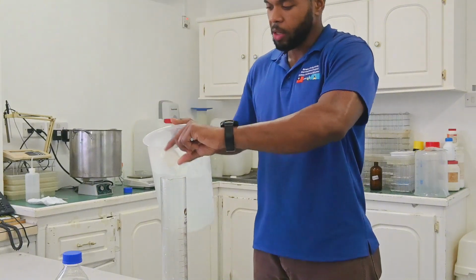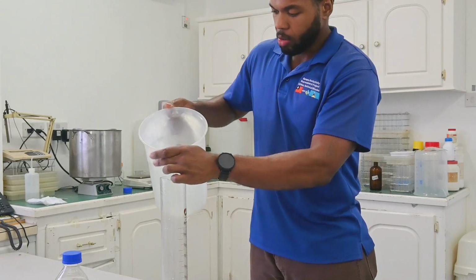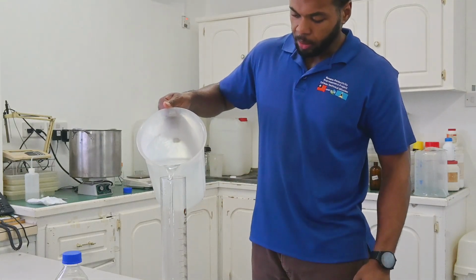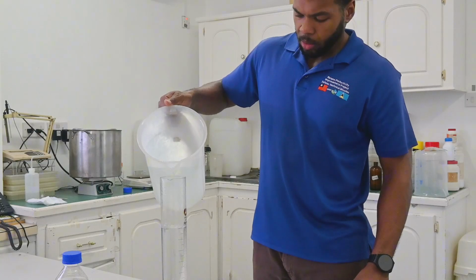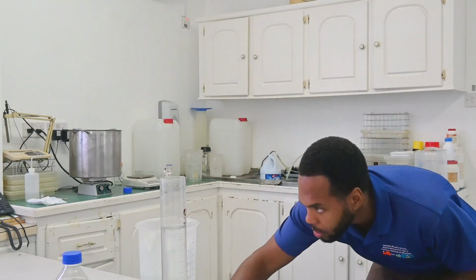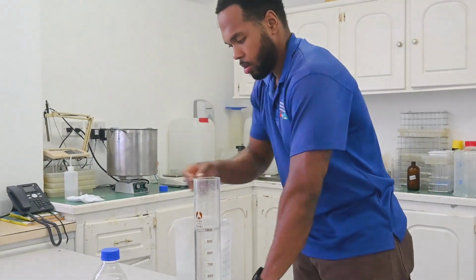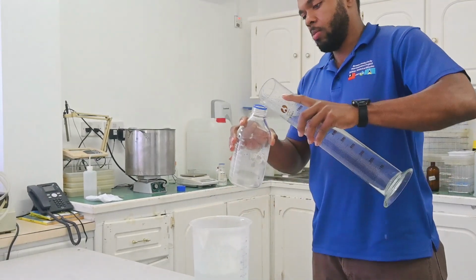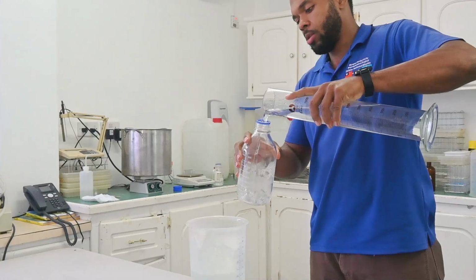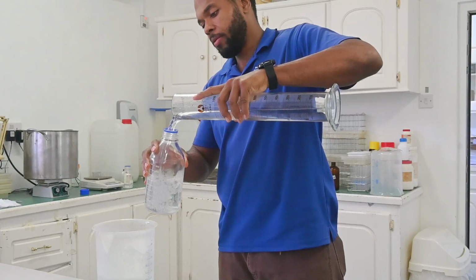Just get everything off the tray, everything off the glass rod. The concentration remains the same. Bring the volume up. Check our volume. 1,000. Just put it into a bottle to put into storage in the fridge, and it should last between 2 weeks to a month.